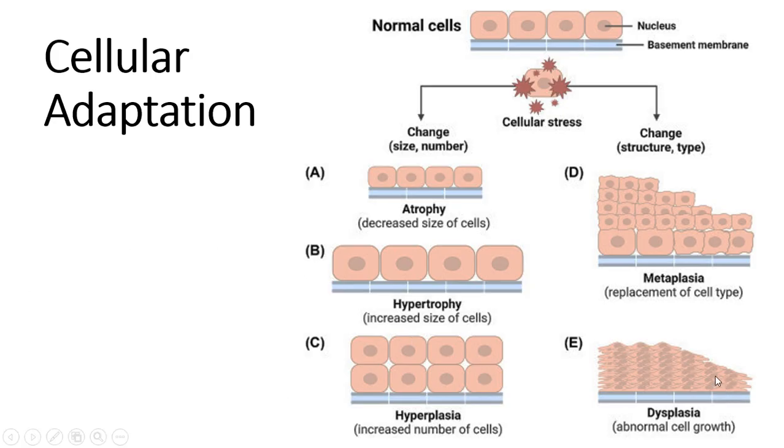For example, in dysplasia that usually occurs in epithelial cells, the proportion between the nucleus and cytoplasm can be 1:1, so the nucleus is as large as the cytoplasm. Okay, that's one thing. And in cases of dysplasia, it is usually located in single or multiple parts.